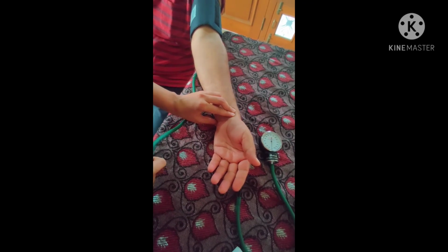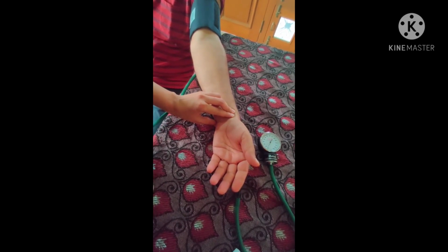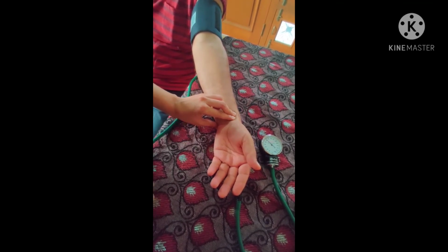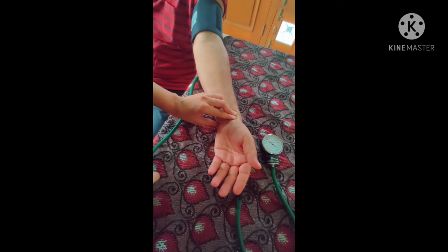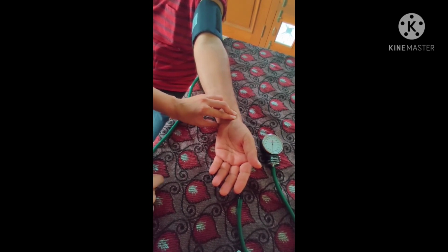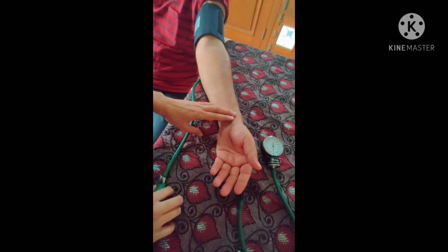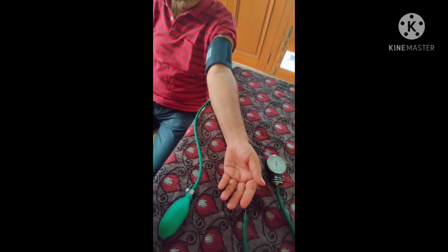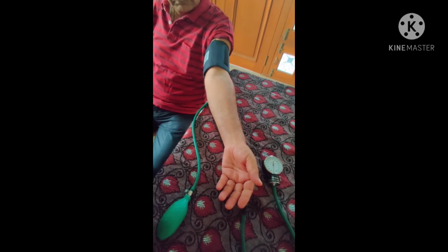First, estimate the systolic pressure by palpating the radial artery with the fingers of one hand. Rapidly inflate the cuff until the radial pulse disappears. Then, to this pressure, add 30 mm of Hg. Deflate the cuff promptly and completely and wait for 15 to 30 seconds. This method avoids the occasional error caused by an auscultatory gap.